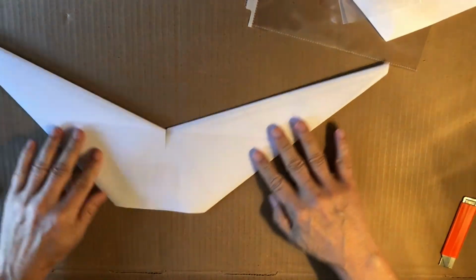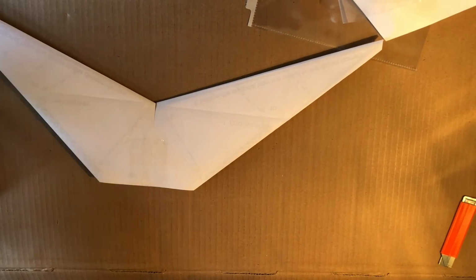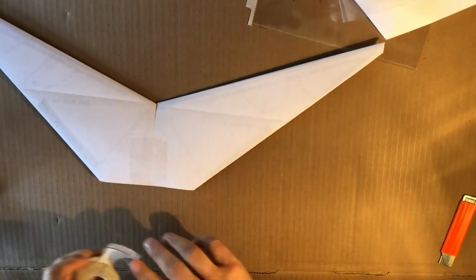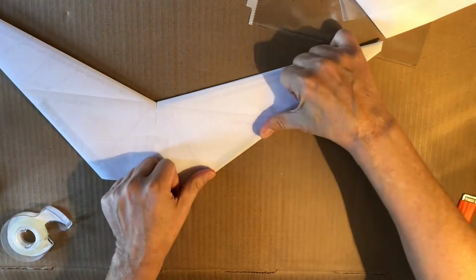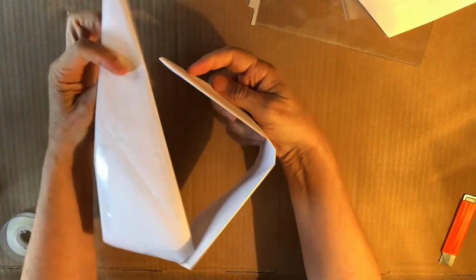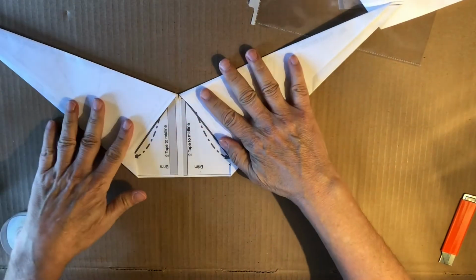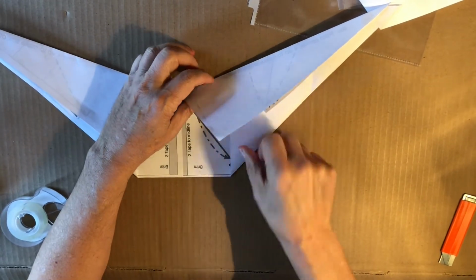Now, because we printed on only one side, but if you look carefully, you can see that I've got this bold squiggle, which is saying attach two-sided tape there. So we're going to do that. Two-sided tape is nice because the plastic we're using can be peeled on and off the two-sided tape. Okay, so that is basically the assembly, and just so you understand, you see this and this ties in the back like a bandana, and this part makes a brim. But now we're going to deal with the plastic. And before we deal with the plastic, we're just going to do a little bit of tape in here just to tidy this up, maybe give it a little more rigidity.